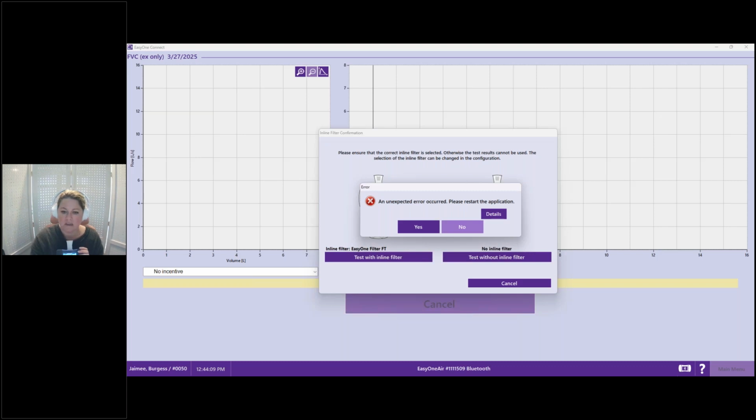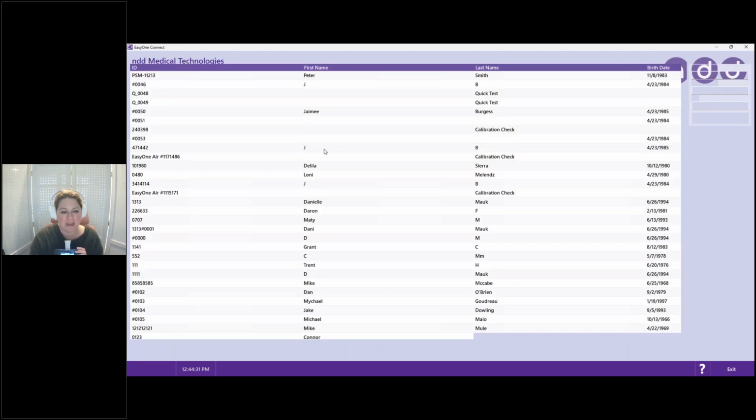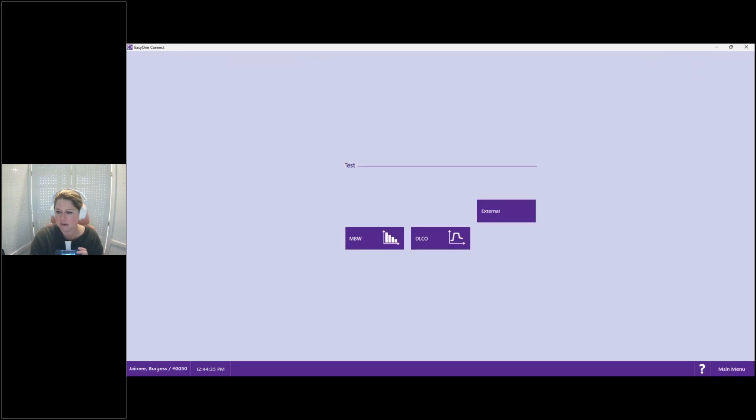All right, it was mad at me because I unplugged my EasyOne PC. So give me just a second here and I'll reshare EasyOne Connect. There it is. All right, I'm going to select myself as a patient and pop over to my test. My Bluetooth might be acting up today. And if it is, we won't waste a lot of time on it.